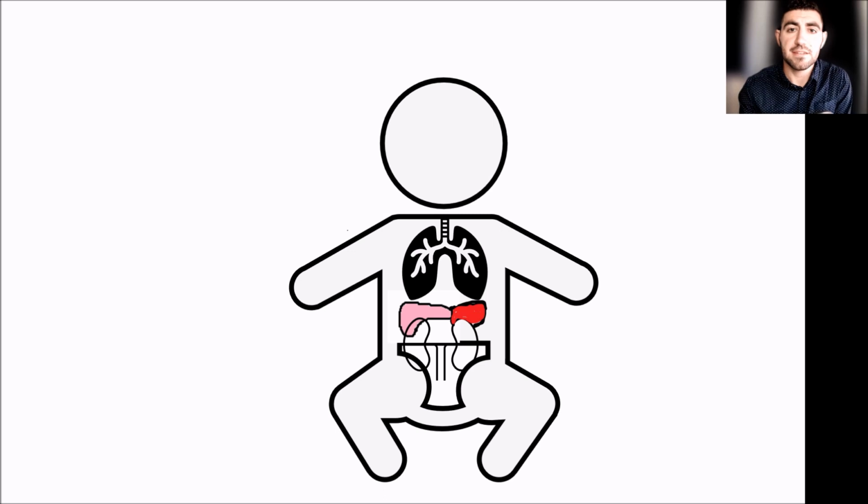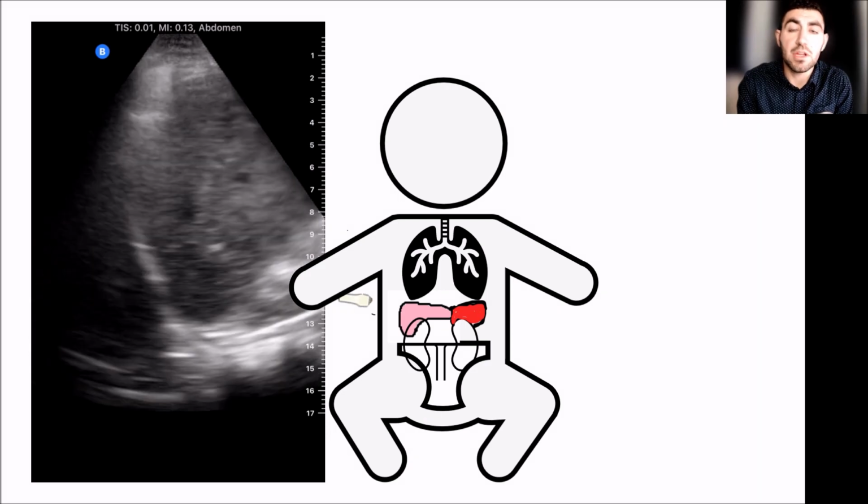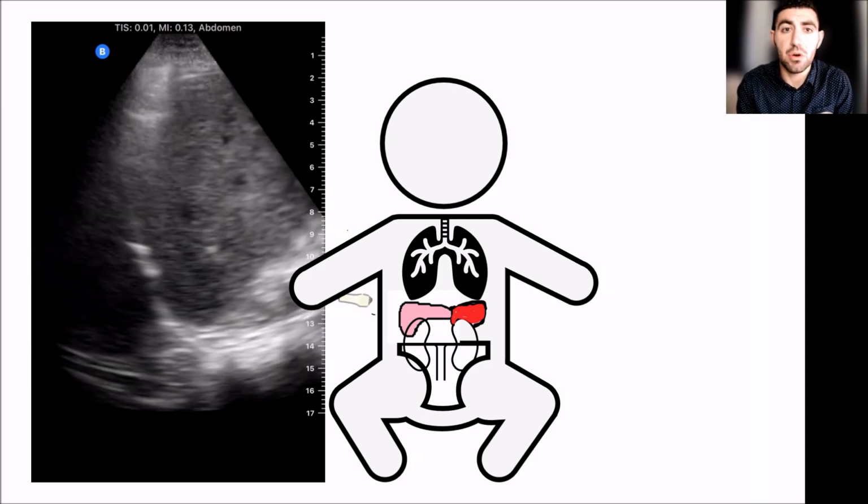The last step of the lung ultrasound is looking for pleural effusion. So in this case, we are putting the probe in the mid to posterior axillary line, right at where we think the diaphragm is. So generally we're going to see an interface between the lung, diaphragm, and then liver on the right, or spleen on the left. And this is what we get. So this is a typical image of a normal healthy lung with no pleural effusion.